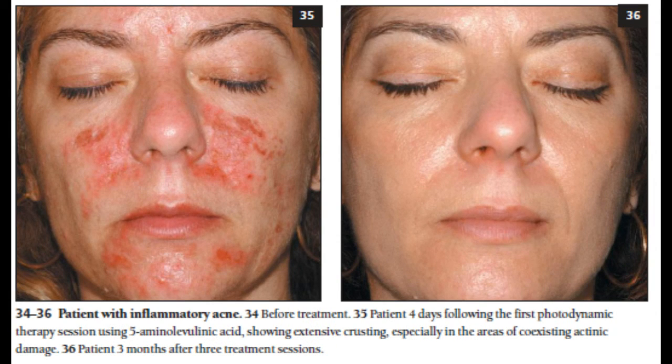In a separate study, a bipolar RF device combined with a broadband pulsed light was used in conjunction with contact cooling, optical fluences of 6-10 J/cm2, and RF energy of 15-20 J/cm3. Patients were treated twice weekly for 4 weeks. No long-term adverse effects were noted, while mild intraoperative discomfort, transient erythema, and 3 cases of first-degree burns were recorded.